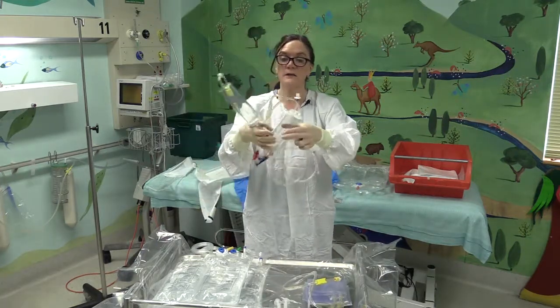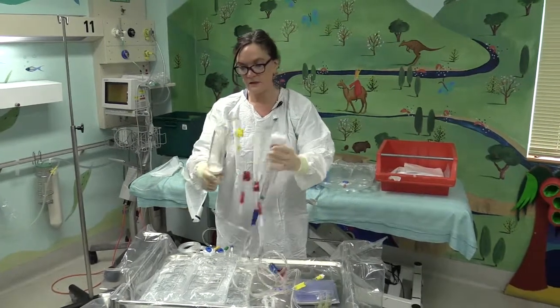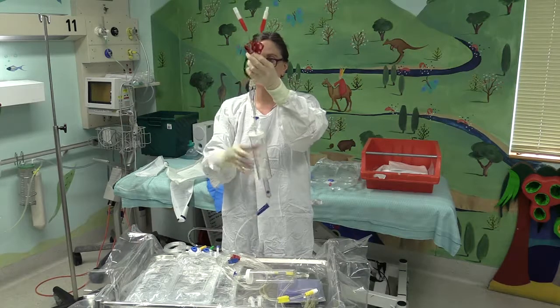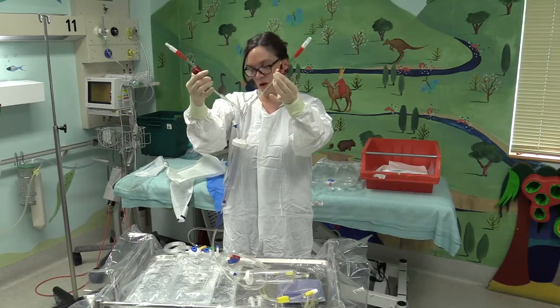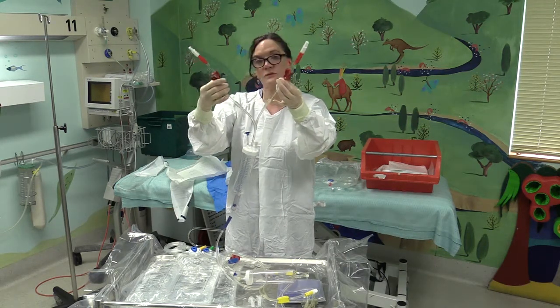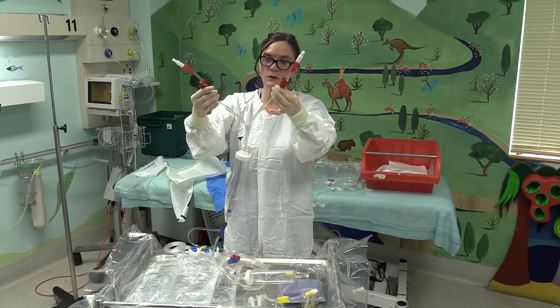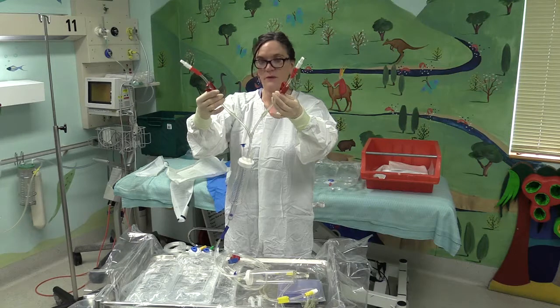This is my peritoneal dialysis giving set, which consists of an administration set with 2 ports to go to 2 bags. So I'm going to hang a 1.5% bag and a 2.3% to start with.